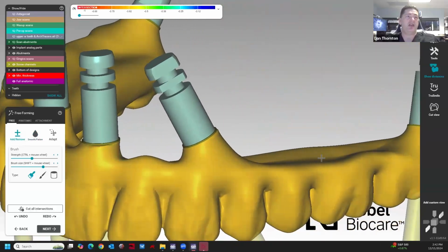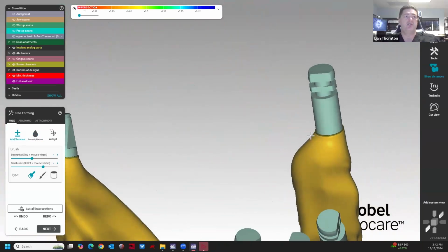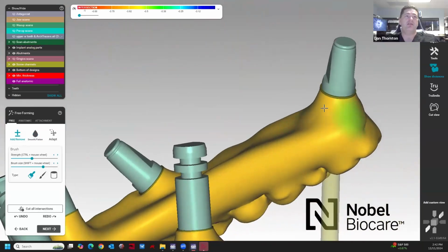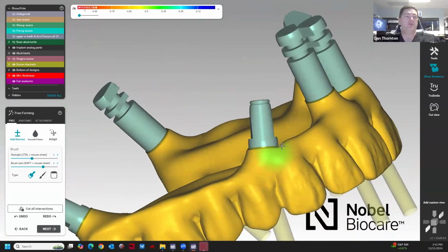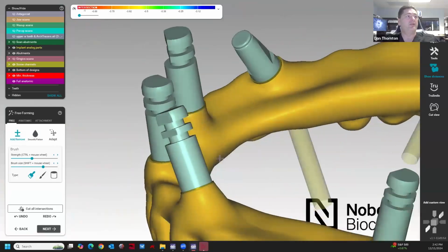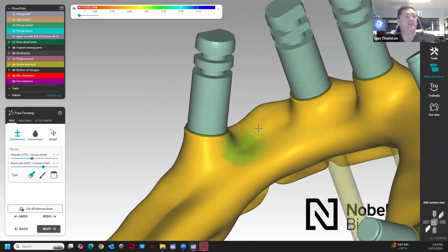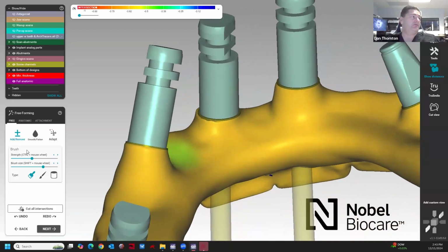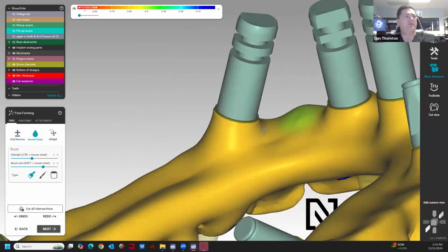Now, with that said, I've had patients that go all the way through until we get to another temp. It has no problem, doesn't break at all. And I've had ones that can't even make it 2 weeks. Sometimes the one that makes it less than 2 weeks is even thicker than the one we're working on here. It's either they're not following the diet they should have, or they just have a really bad grinding habit. That's a time frame.